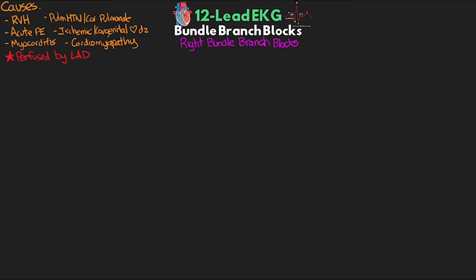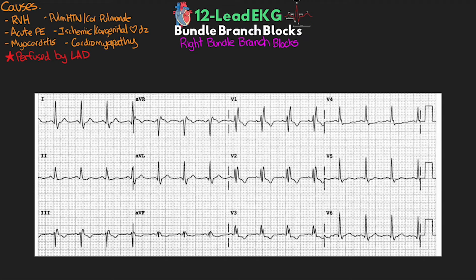Here's our first example of a 12-lead with a right bundle branch block. Starting by measuring our QRS duration — looking at V2, it's somewhere between three to four small boxes, making this a wide QRS. Looking at V1, we can see the classic rabbit ears or M shape typical of right bundle branch block. The terminal wave is positive — using our turn signal flipped up, we're turning right, thus right bundle branch block. We also have appropriate T wave discordance with a negative T wave deflection. In V6 and lateral leads 1 and AVL, the terminal deflection is negative, opposite of the positive terminal deflection in V1.